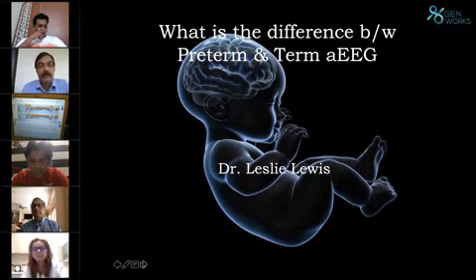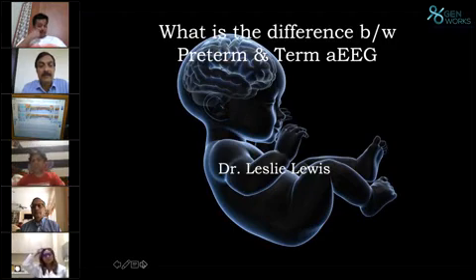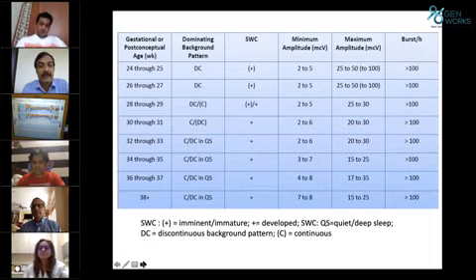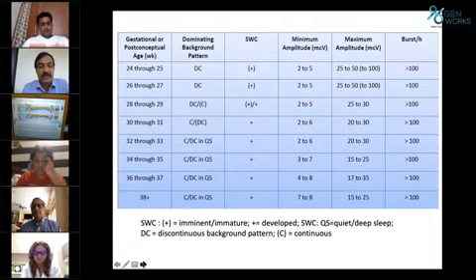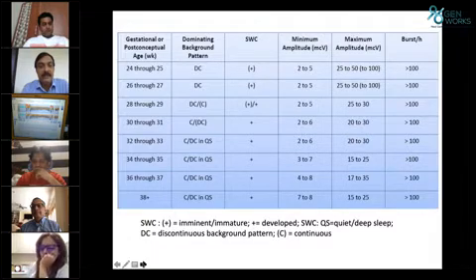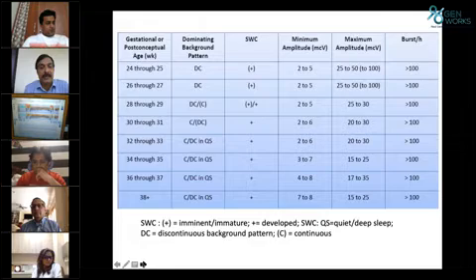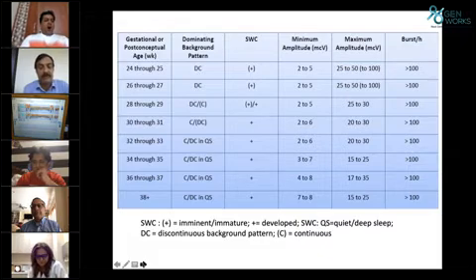Yeah. First of all, I must thank Dr. Dinakar for opening up this new arena of using amplitude integrated EEG, not only for the HIE babies, but also for our preterm babies and other babies. And he has done a wonderful job with the help of NNF. Dr. Judy has already explained in a very crisp way for the last 1 hour using amplitude integrated EEG in preterm babies. She has also shown the same picture. I just want to recap what she has mentioned.